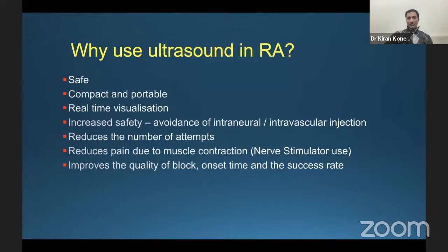I hope it is going to be very useful in terms of increasing the safety, especially by avoiding any intraneural or intravascular injections, which can be lethal, and also reduces the number of attempts so that we don't need to go around, and reduces the complications from them as well, especially around the lung, pneumothorax or hemothorax, and also reduces the pain due to muscle contraction, especially with use of a nerve stimulator. And at the end, it improves the quality of our block and also the onset time and success rate, which are our primary targets.